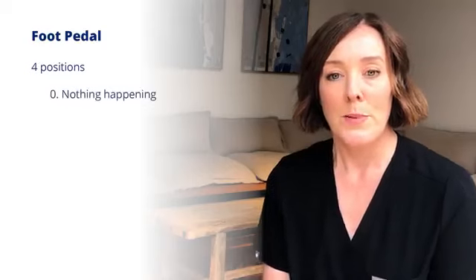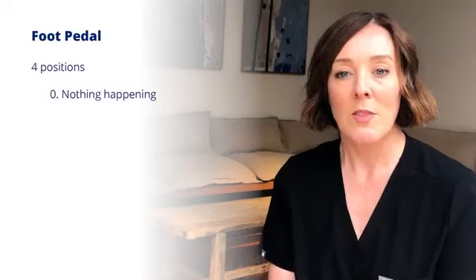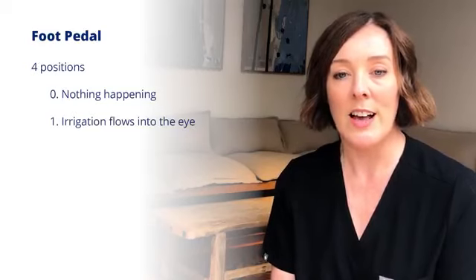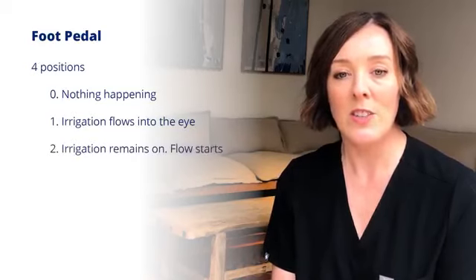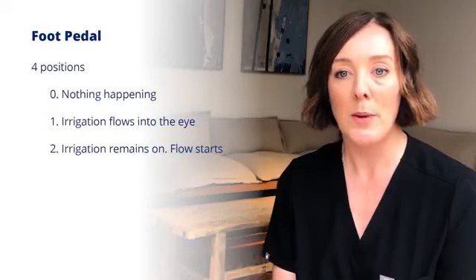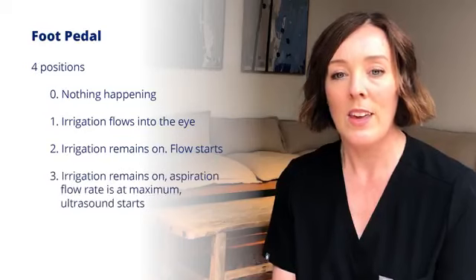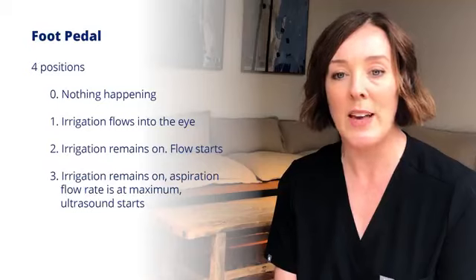The foot pedal has 4 positions. Position 0, nothing's happening, or it's turned off. Position 1, the irrigation flows into the eye. In position 2, the irrigation remains on. The pump begins to turn, so aspiration flow starts. Aspiration flow rate is preset. In a pump setting, if occlusion occurs, vacuum will start to build. In position 3, irrigation remains on, aspiration flow rate is at its maximum, and ultrasound starts.